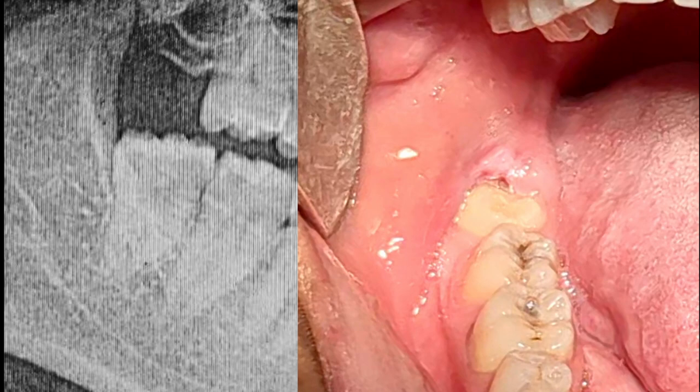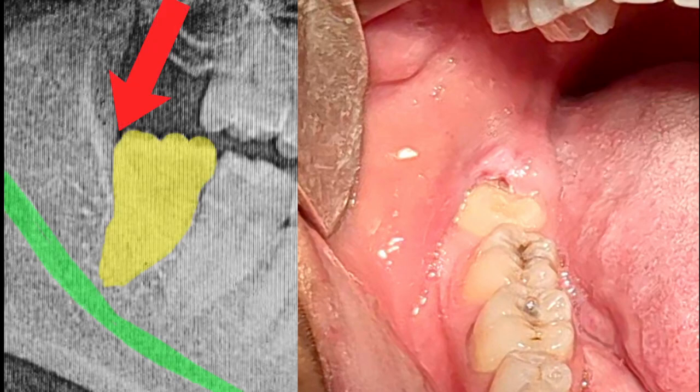Today, I am going to show you the surgical removal of an impacted mandibular right third molar. Clinically, the distal cusp of the tooth is covered by the pericoronal flap. Radiographically, we can see that the bone distal to the third molar is above the CEJ level. So some bone removal is required to extract this tooth.